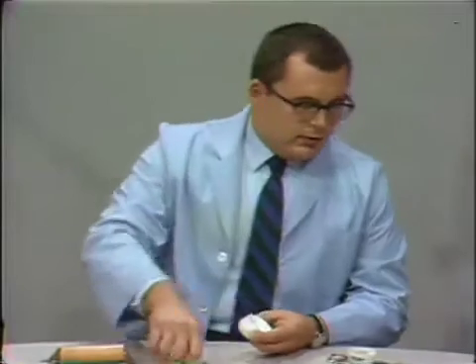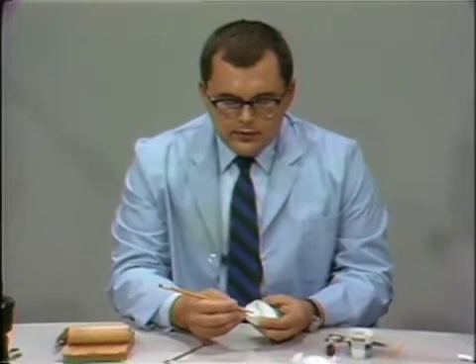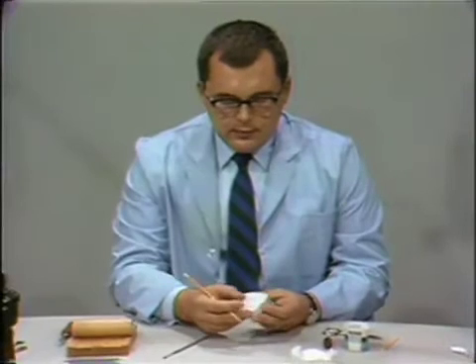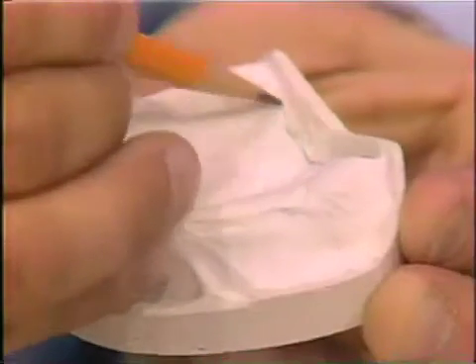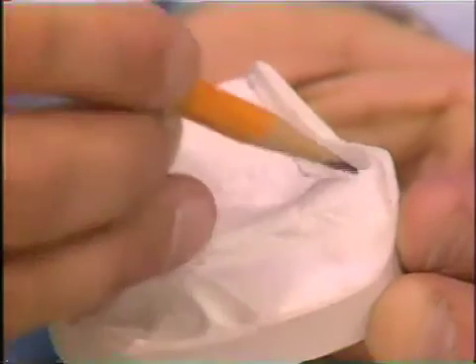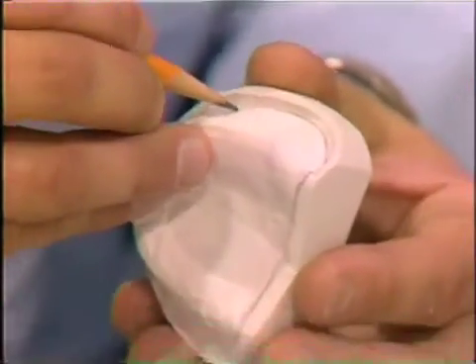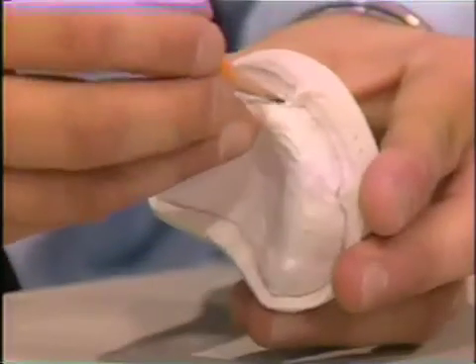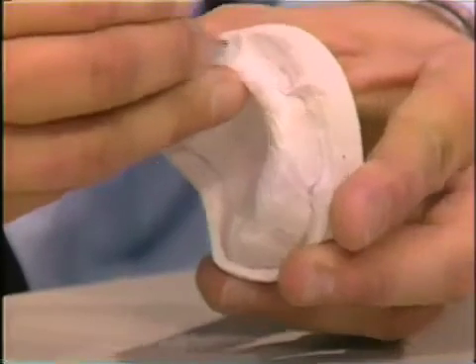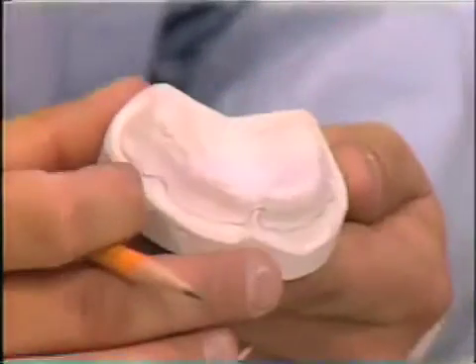To begin with, I'd like to outline on our cast the area that we will be covering with our final impression tray. This is the first step in constructing the tray. If you can find the fovea palatini in the preliminary impression, you can pencil just beyond that area, over your hamular notches, into the buccal vestibule, the buccal frenum, the labial flange, the labial vestibule, the labial frenum, and the same on the other side. It's fairly easy to follow the anatomy of your cast even if it is a little bit overextended.